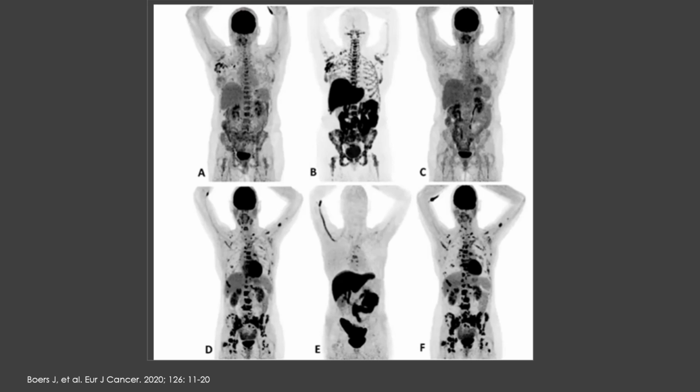These are two separate patients. Patient 1 is on the top row and patient 2 is on the bottom row. So top row is the FDG study, the FES study in the middle, and then FDG follow-up. This patient was HR positive and responded to treatment.